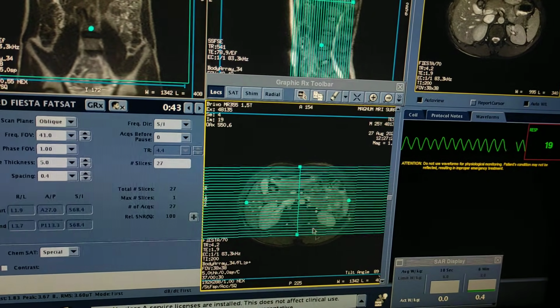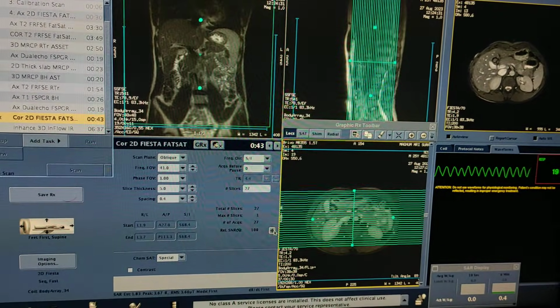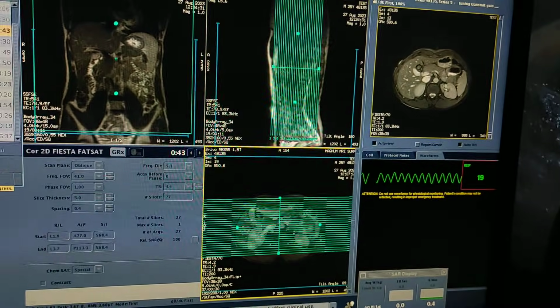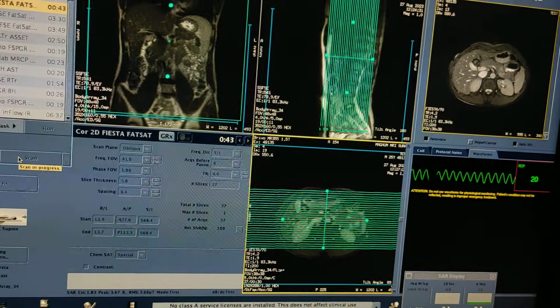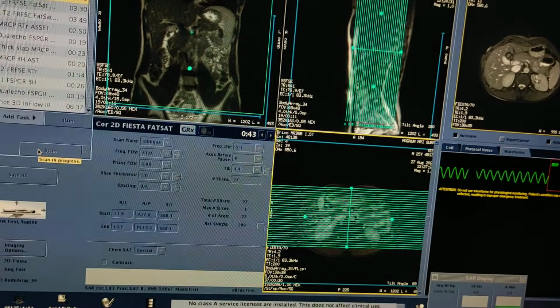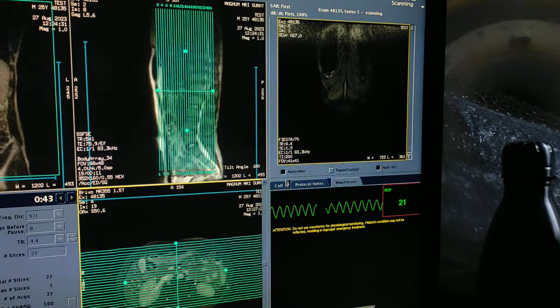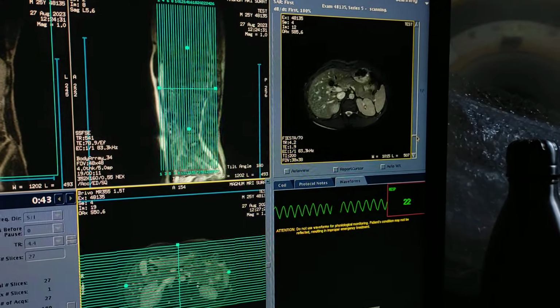Anterior to posterior you have to simply cover. This is just planning sequences. If sometimes the patient is not taking a proper breath, at that time you can use this 2D Fiesta sequence, but at that time you have to run this sequence with breath hold, okay, for a better resolution. Here you can see, without breath hold my images are very good over here. You can see this.